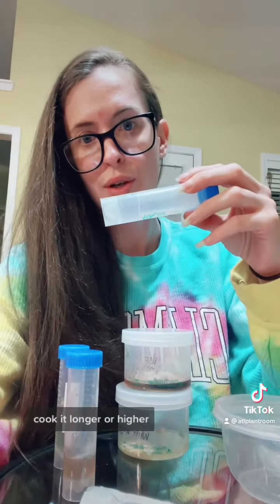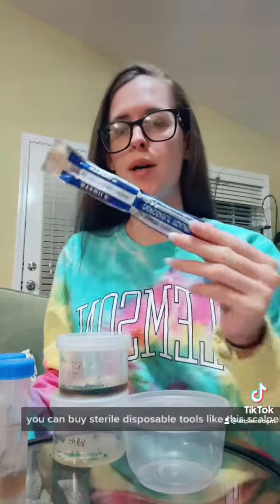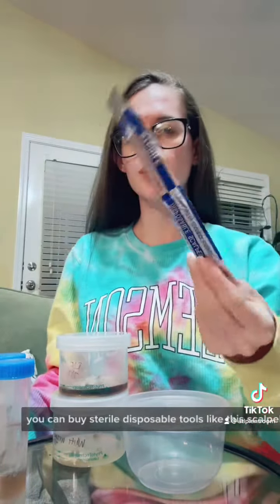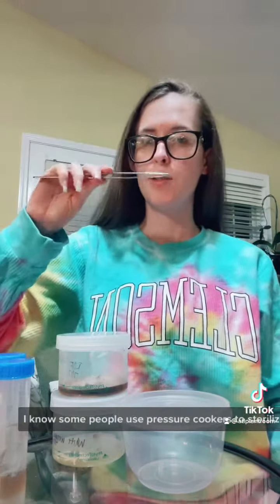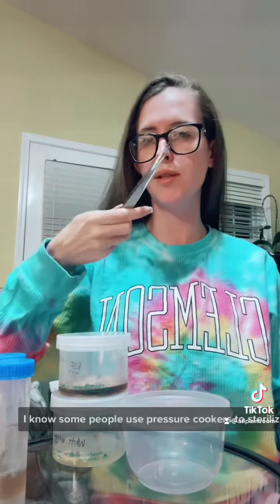Media — cook it longer or higher. Your tools: you can buy sterile disposable tools like this scalpel, or put them in an autoclave. Some people use pressure cookers to sterilize these too.